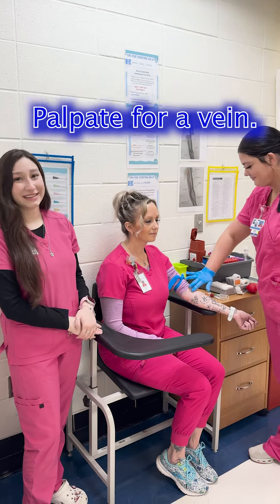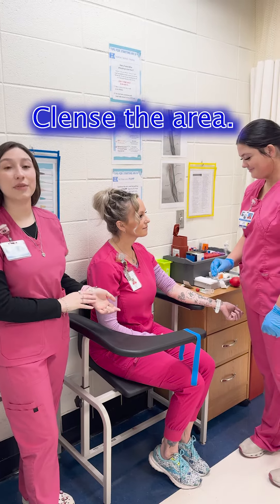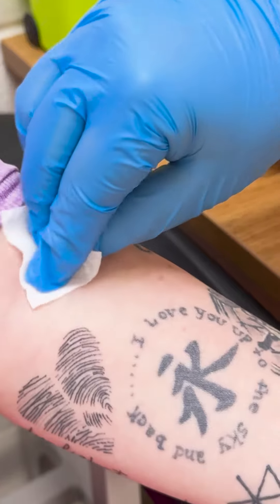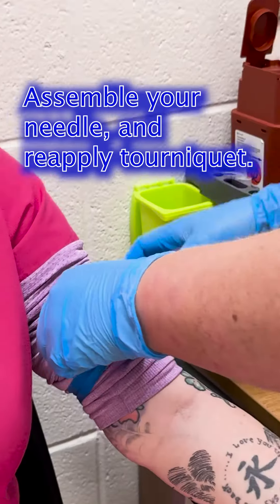Now you're going to palpate for the vein. For the next step, you're going to cleanse the area with an alcohol pad and allow for it to dry. While the alcohol is drying, you're going to assemble your needle and then reapply your tourniquet kit.